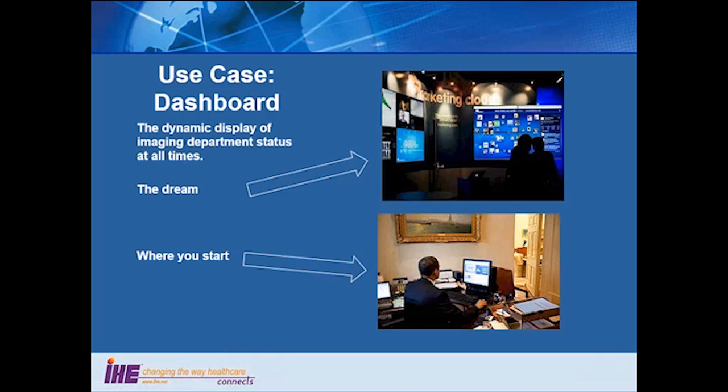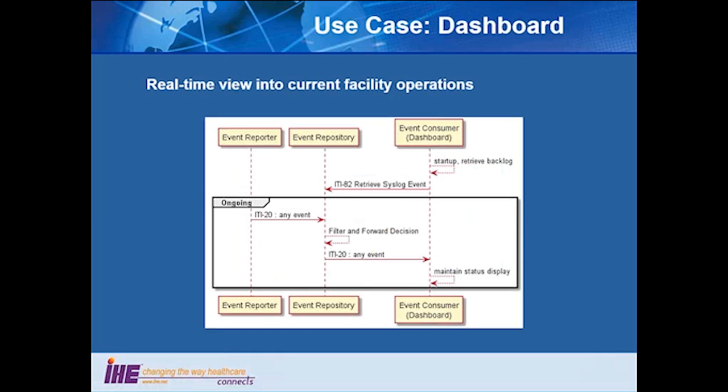Everyone would love dashboards. We have the great marketing vision, the more realistic vision, and we just had to explain the existing audit transactions. You can use the filter and forward that's been defined to forward the relevant ones to a dashboard so that it can do a continuous update.